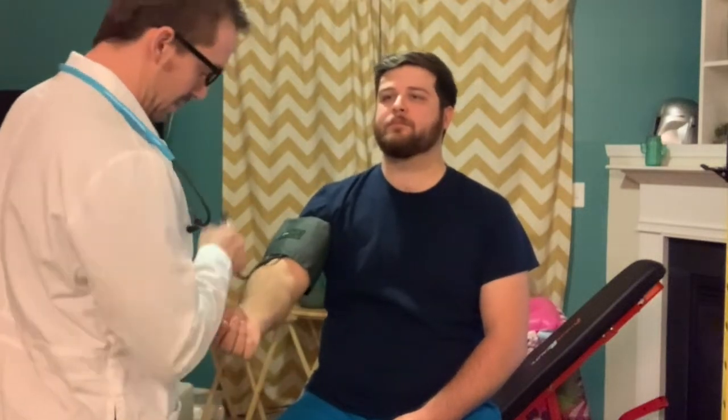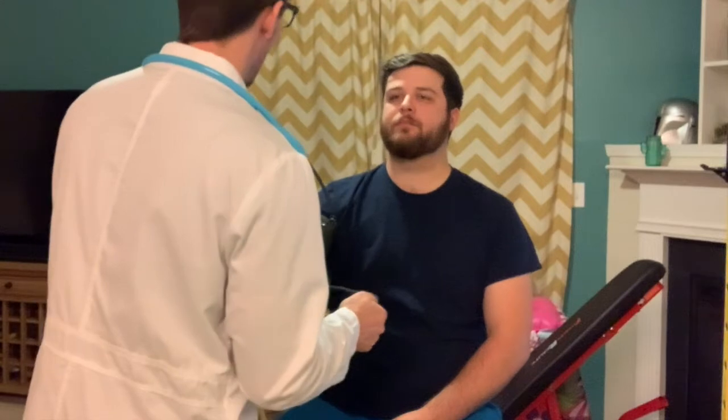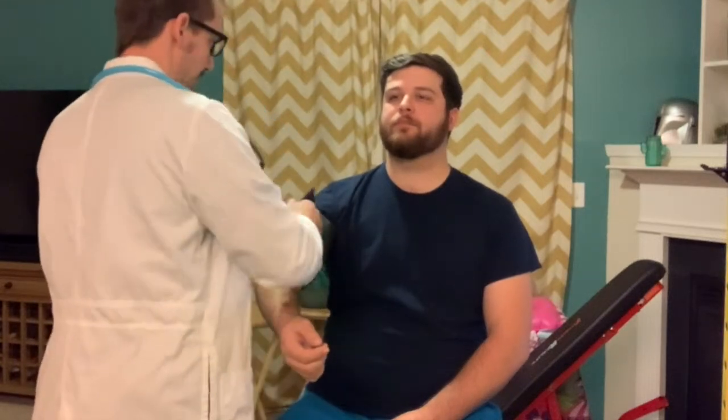So if you just relax your arm. There we go. All right, about 122 systolic blood pressure.